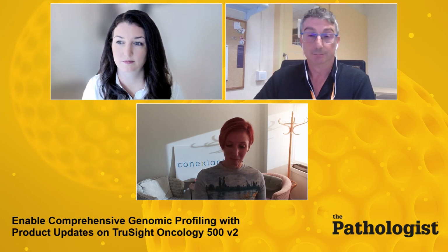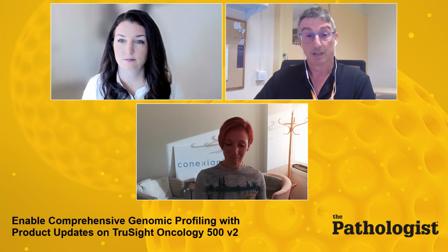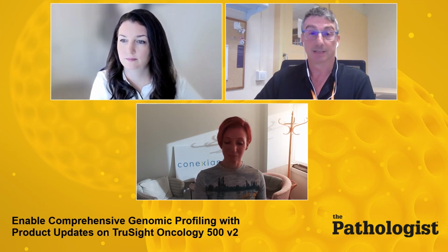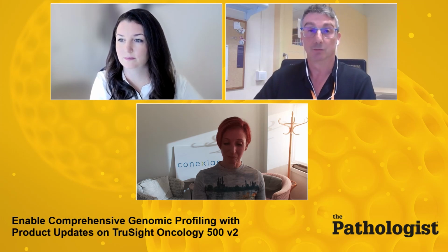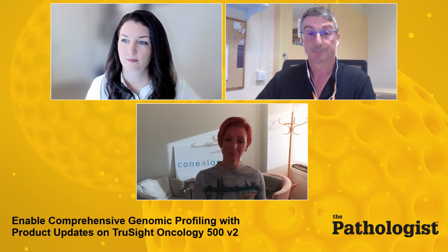If we obtain a result from DNA or from RNA, and the oncologist needs the results to give the correct treatment, we can elaborate the report. But before, we discuss in a molecular tumor board, we always need to obtain more sample and obtain the other part of the result. Thank you, Daniel.